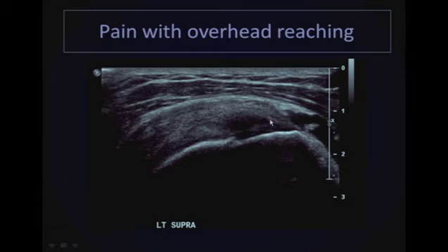Is this anisotropy? So first, you would reorient the transducer to make sure, but second, you can already see that where we have the tendon at 90 degrees to the sound, we do not have those parallel lines. So this is a patient with tendinosis, and this is part of the tendinosis and is not anisotropy.